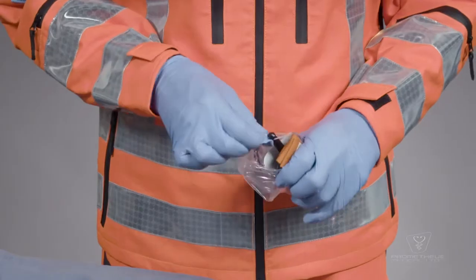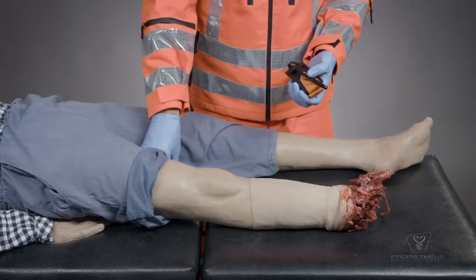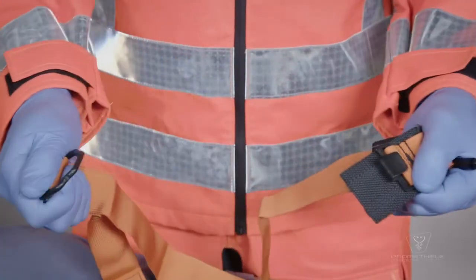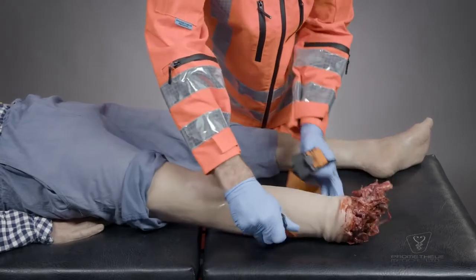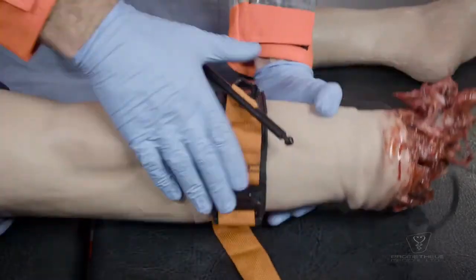First, remove the device from its packaging, take off the elastic bands, and unwrap the device. Slide or clip the tourniquet around the limb above the bleeding site and pull tightly. Twist the windlass as many times as possible.